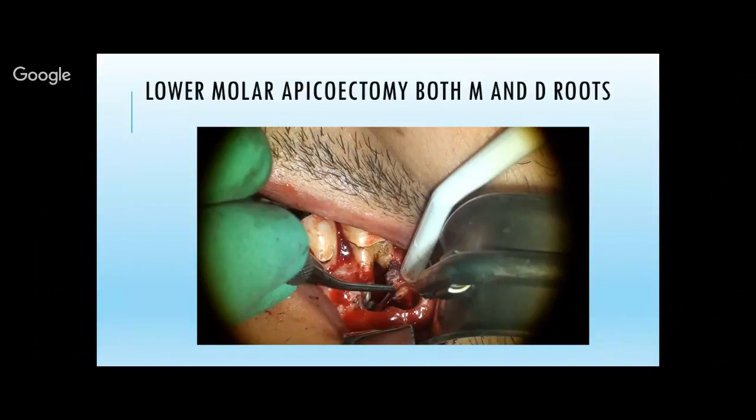A question that came in previously, if you've ever used the SIC drill set for this. The SIC drill set? Are you familiar with it? No, I'm not. Is that for apical surgery or access guide? The question came in earlier, so I believe it's connected to the access guide.